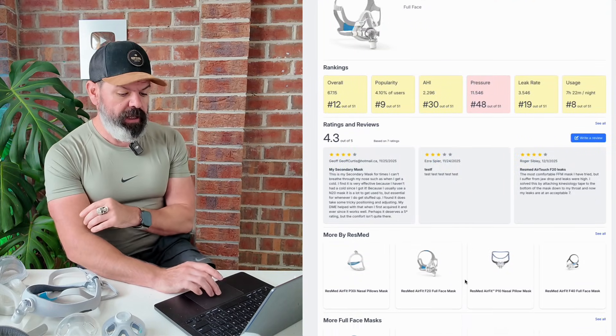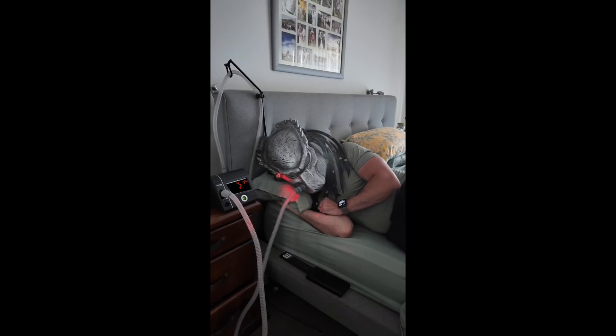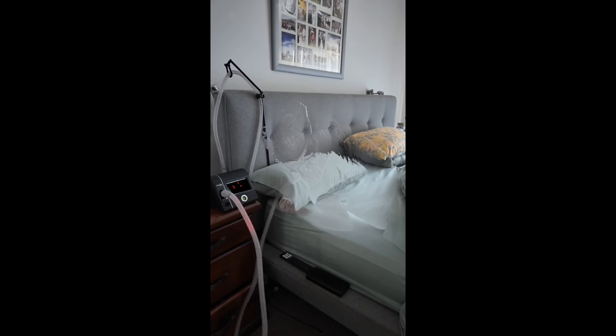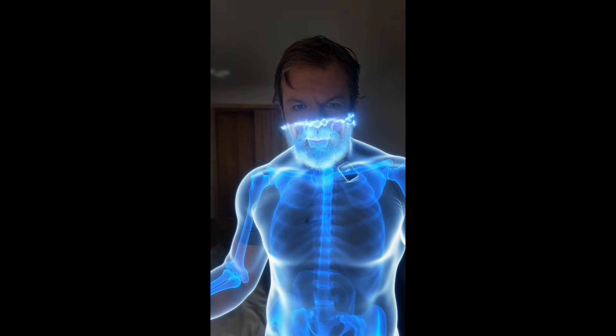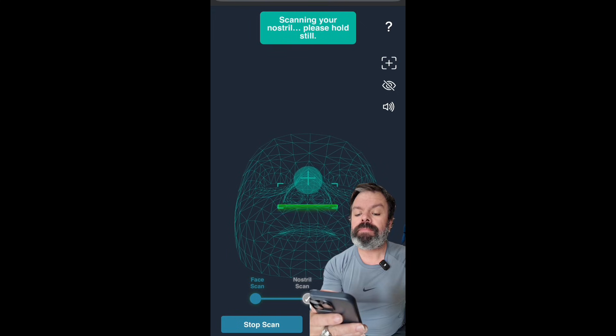If you're a SleepHQ Pro member, you also receive free unlimited access to MaskFit IQ. This is a facial recognition tool — it'll scan your face to show you what mask size you are and what are the best masks for your unique facial profile. You can just click MaskFit IQ. Here's how it works: scanning your face, please hold still to scan your nostril. Scanning complete.